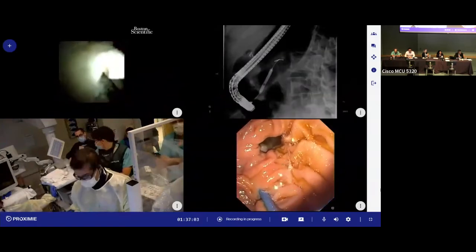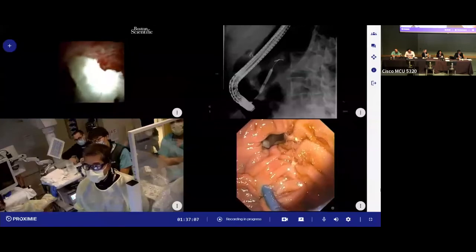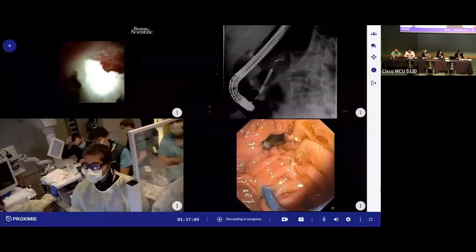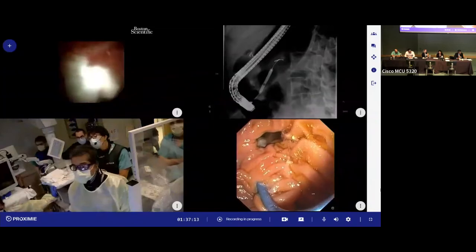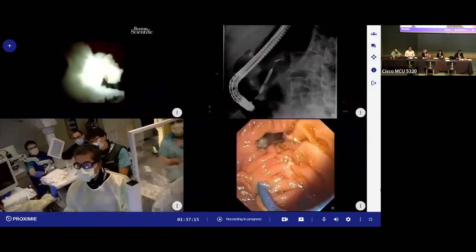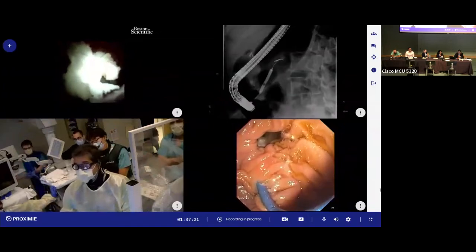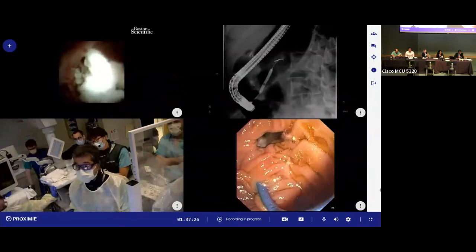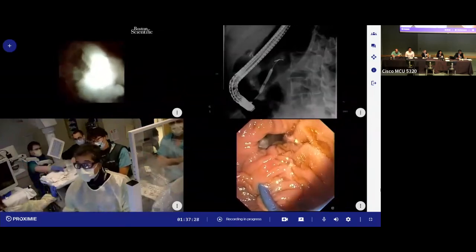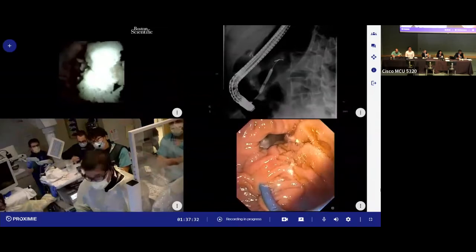Usually with stricturoplasty, we do a little bit of cautery and balloon dilation, so I like that. We're going to balloon dilate that area again once we get the wire up, and then we're going to get a stent out to the tail. I already told her that we'll break up the stone, hopefully. But the ability to remove all the fragments in one session is really not feasible. That's not practical, so we'll stent across it. Hopefully that'll lead to improved pain management for her, and then we'll bring her back in 6 to 8 weeks for continuing this treatment.